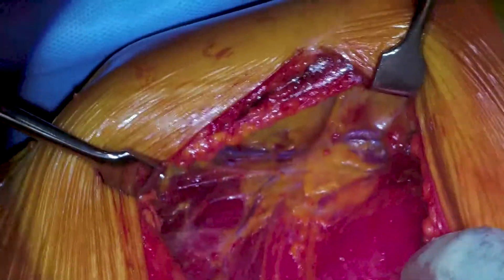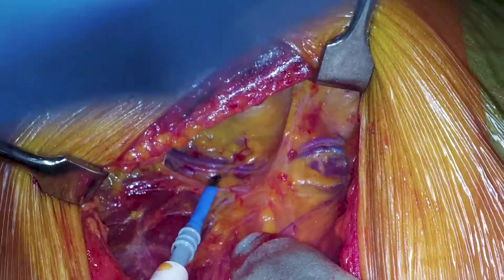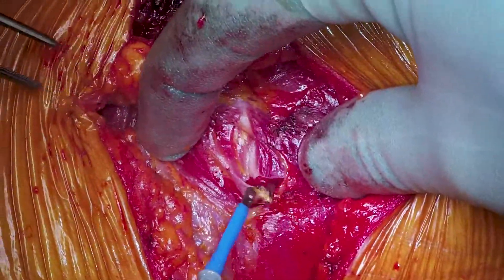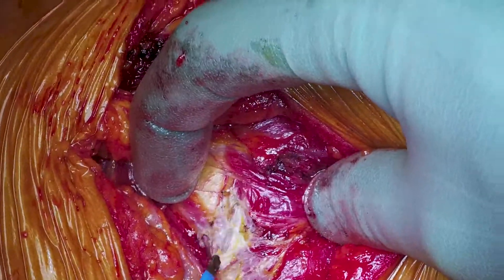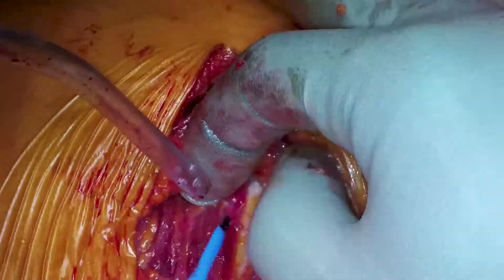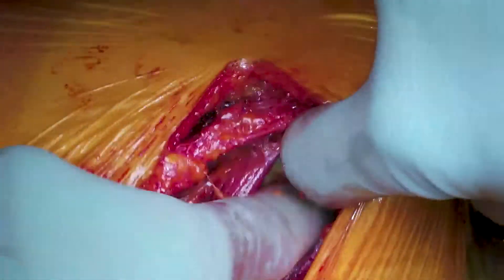This view shows a retracted latissimus, and we're highlighting the anatomical position of the long thoracic nerve — if you accidentally dissect that during the operation, you'll cause winging of the scapula. We're cutting serratus anterior in the line of its fibers to gain access to the fifth intercostal space. Once you've dissected through and can see the fifth intercostal space, you can place your finger through and over the ribs, counting from the second rib downwards to confirm you're in the right spot.